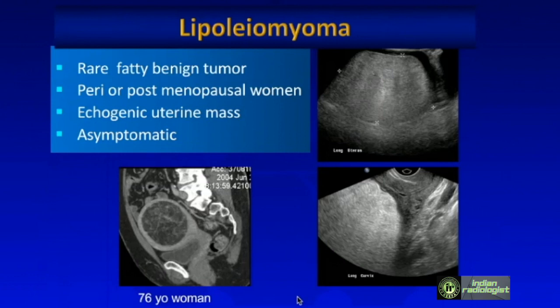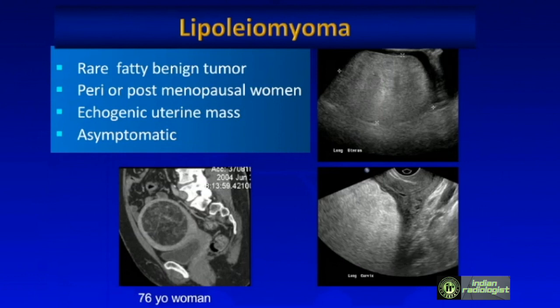There is also an unusual rare lesion: a lipoleiomyoma, a rare fatty benign tumor that typically affects peri- or postmenopausal women around ages 45 to 55. It appears as a very echogenic mass with areas of shadowing within the uterus — basically looks like a large cystic teratoma except it's in the uterus. CT confirms a predominantly fatty mass. This particular patient was 76 years old.